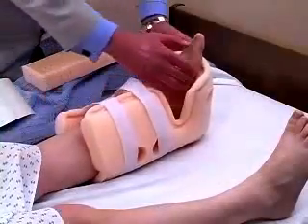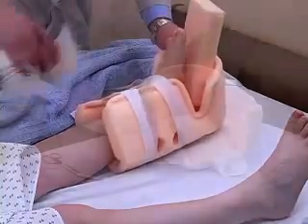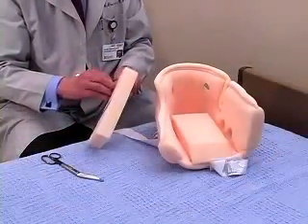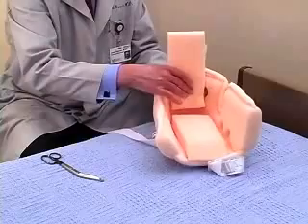Should the patient have a problem with a heel cord contracture, the spare pad can be placed between the forefoot and the front of the boot. In this case, remove only the backing paper that will be used to adhere the pad to the boot, and leave the backing paper on the upper part of the pad so that the pad will not stick to the sheets.